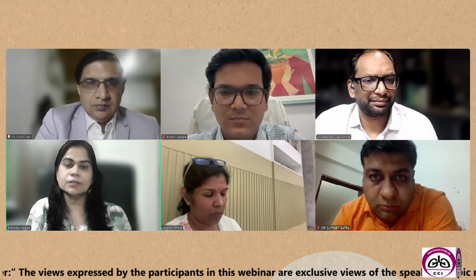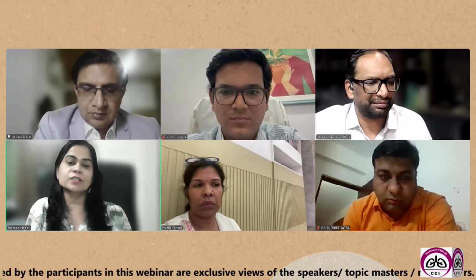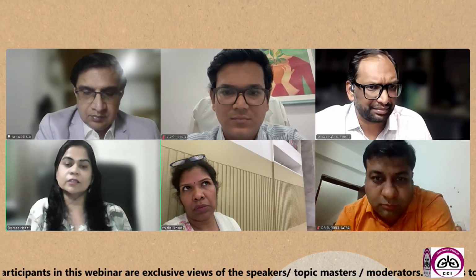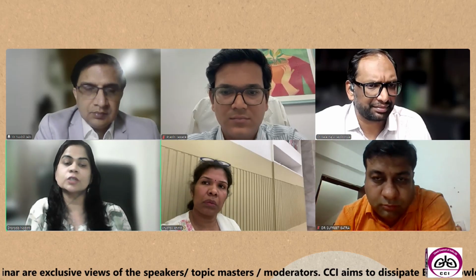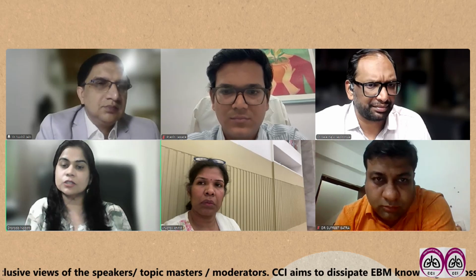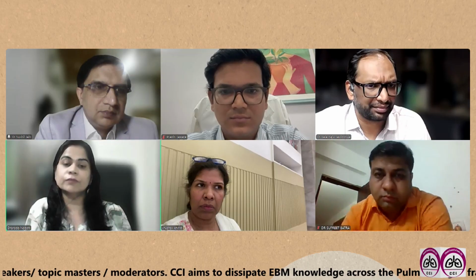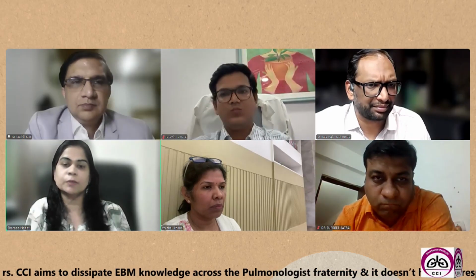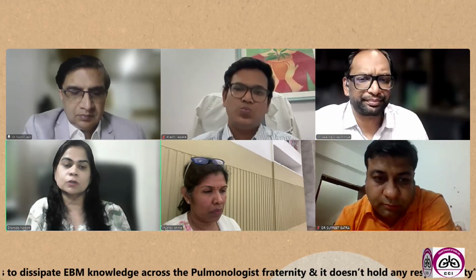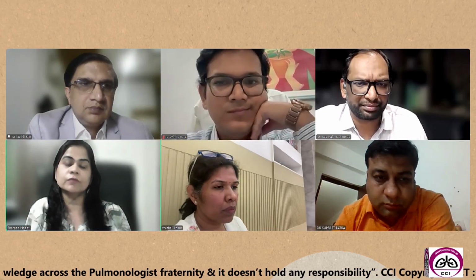So having said all this, I would like to highlight this point that we cannot reliably distinguish between sarcoid and a mycobacterial infection based only on cytology, unlike in a biopsy. In biopsy, we take into consideration many other soft clues like presence of lymphangitic distribution of the granulomas, absence of organizing pneumonia, absence of inflammation in the surrounding lung parenchyma. All these go more in favor of sarcoid. In biopsy, we have all these soft clues, but in cytology, we don't have these clues. So that is the reason why we cannot reliably distinguish between a sarcoid and a mycobacterial infection based only on cytology.